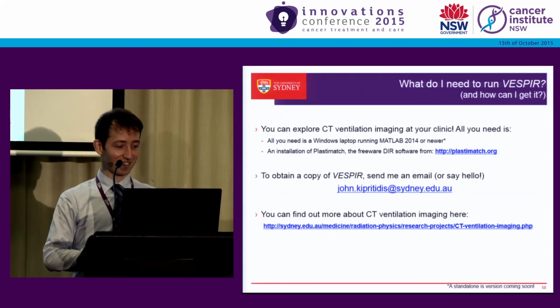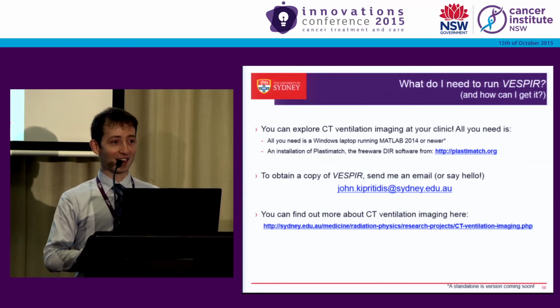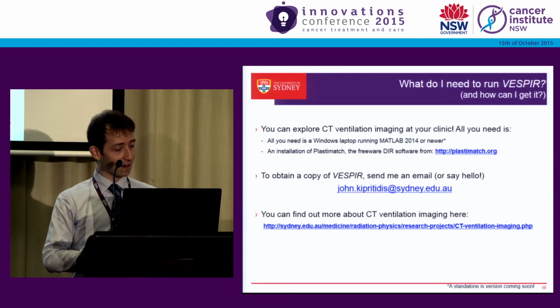I've said Windows here, but that's not really necessary. If you're willing to compile code, and perhaps a few of you are, you can do this on your Mac or your Linux machine, and before long, you won't need MATLAB either.